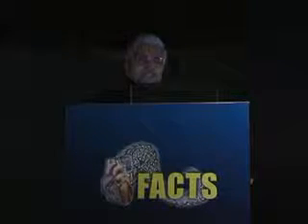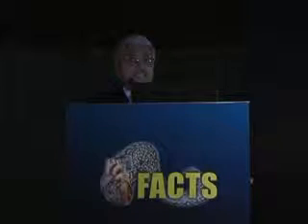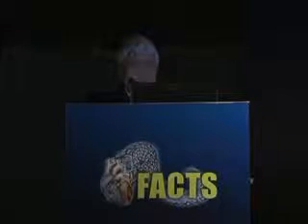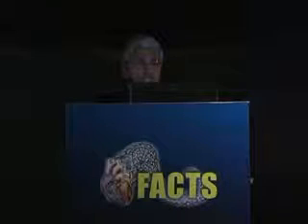A 71-year-old lady who was first diagnosed to have coronary artery fistula 4 years before the procedure. She refused any intervention until she went into atrial fibrillation and had congestive heart failure. So when we took her up, she really had pulmonary edema, on ventilator, a hypertensive atrial fibrillation patient. Here again we had a CT angio. Look at the long tortuous fistula which is opening into the RA.